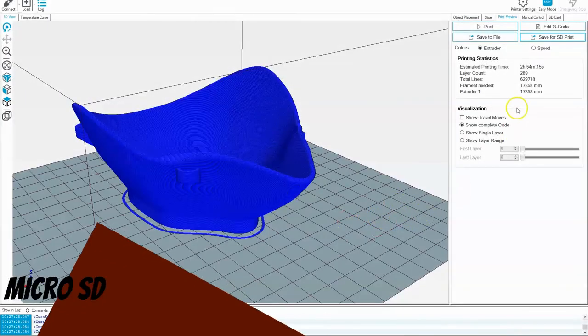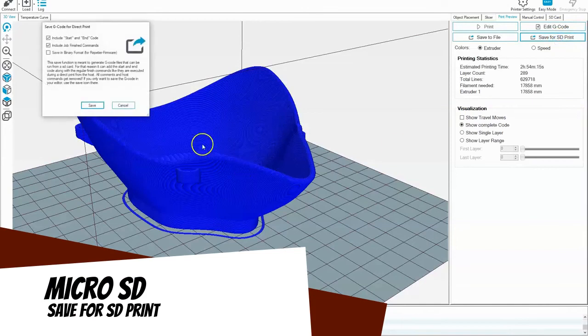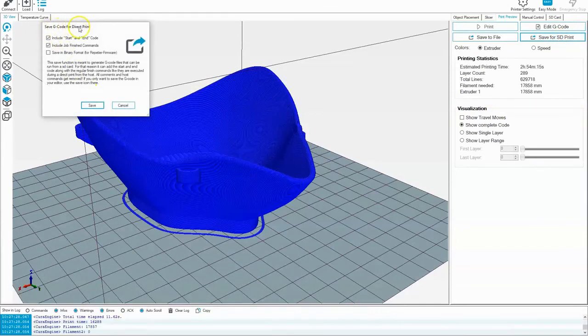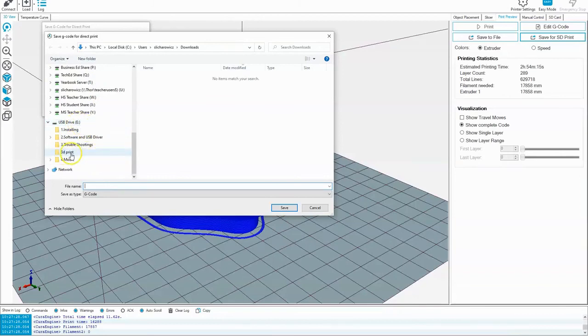Okay, after inserting the micro SD card transfer unit and SD card into the computer, I'm going to come up here and click on Save for SD Print, and then Save G-Code for Direct Print. I want to keep Start and End Code on, and include Job Finish commands. Okay, then I hit Save, and now I want to move through my file structure here until I find that USB drive in the E drive, and I'm going to find the folder for 3D prints. Okay, I'm going to put all my 3D prints in here.